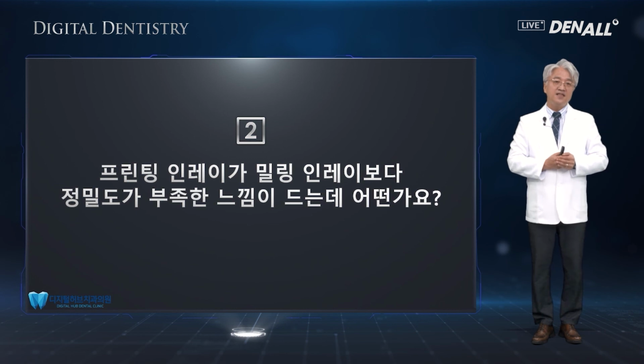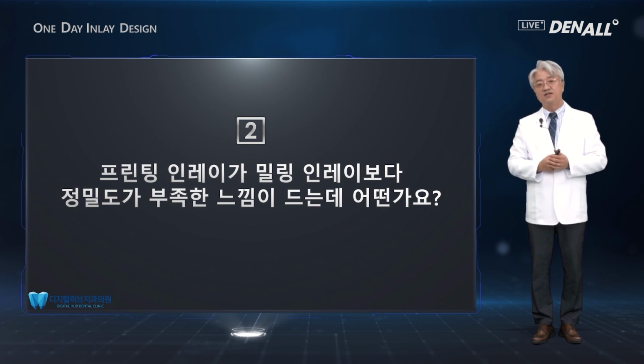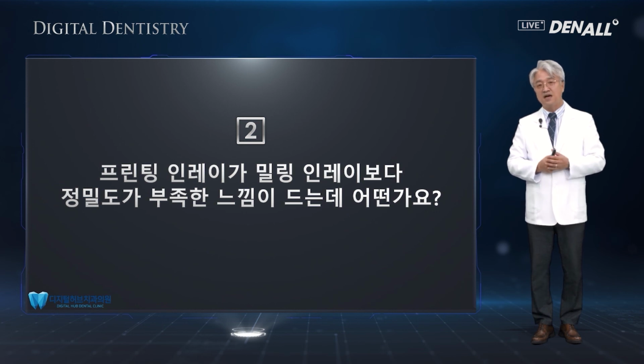But still, printing inlay come with also other advantages. Mass production is possible, and the production cost is also low, and the time compared to milling is also shorter. And again, as you can make many inlays at one go, of course, it might be not as precise, but I do believe going forward, printing inlay will be the preferred option.